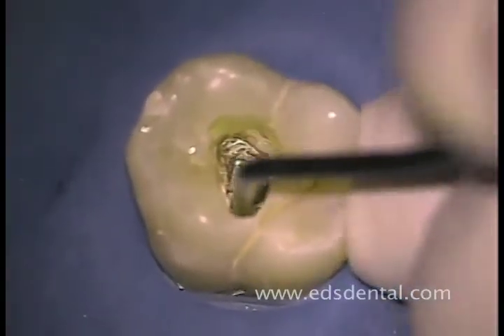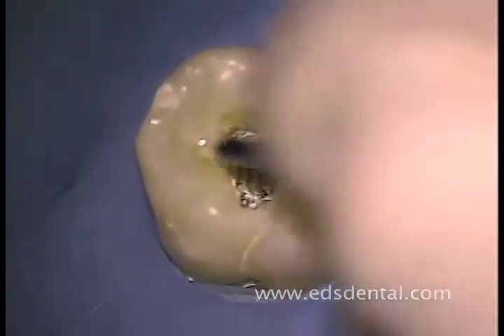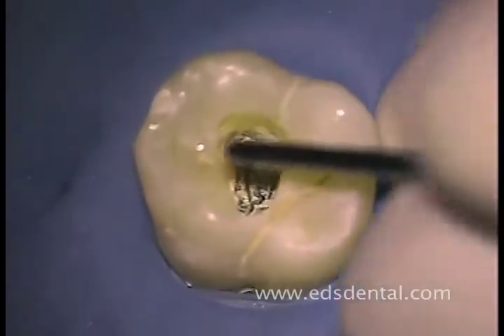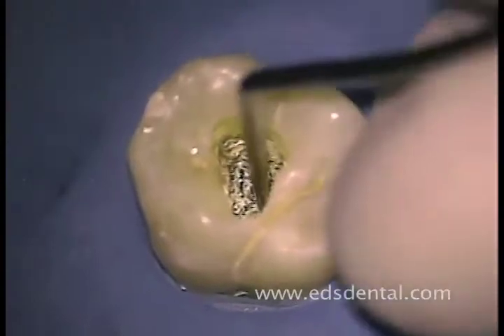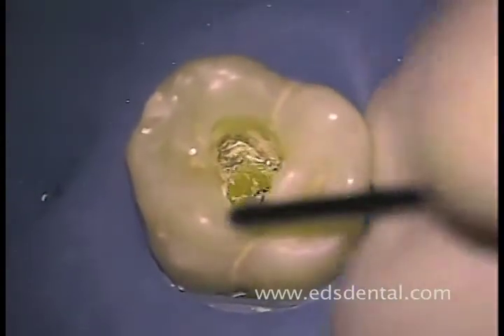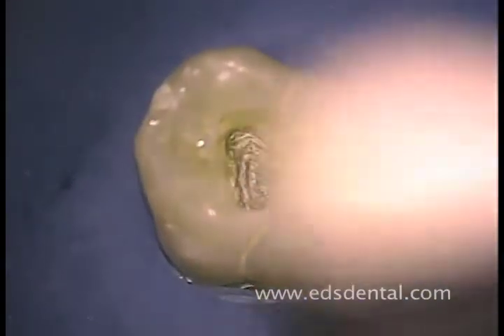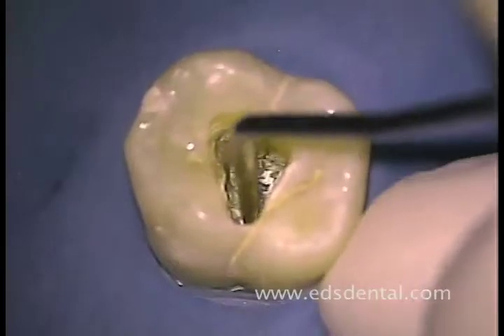It is merely an opening through the roof that is aligned with the mesial buccal portion of the floor. Once the hole is large enough for the head of the burr to go through, I pull up the rest of the roof, being careful not to gouge the axial walls of the pulp chamber. Exploring the floor of the pulp chamber, I am able to pick away a detached pulp stone from the distal palatal floor of the chamber.